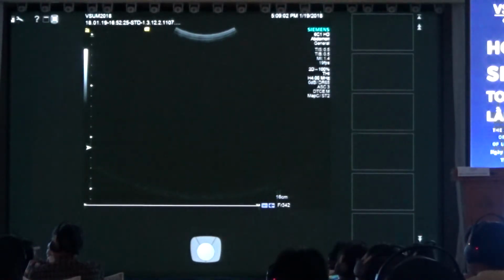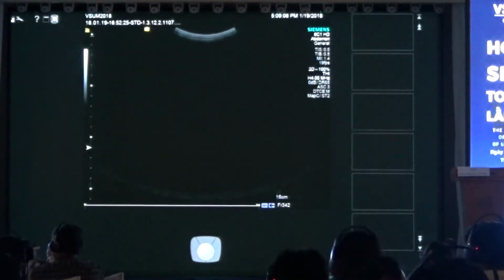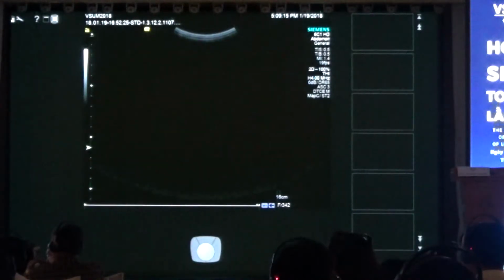If you look at the FibroScan papers, they would say that in the mid-axillary line in a supine position, you should measure. We will see right now what happens if we do so. And then we might take the second point. But first of all, I will start in that way that we look like we are recommended if we do the liver exam.